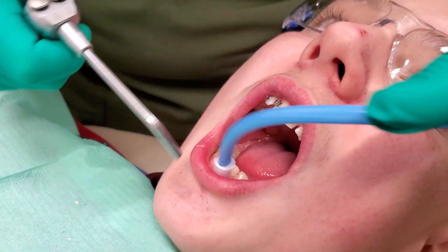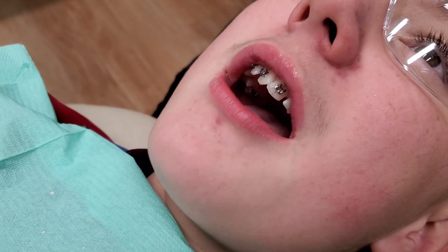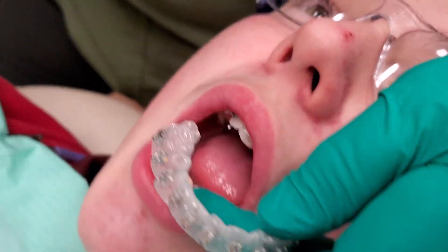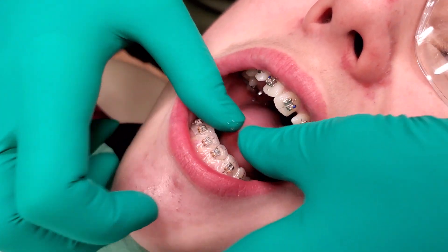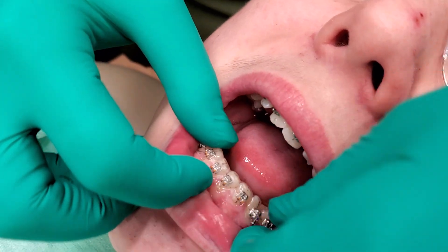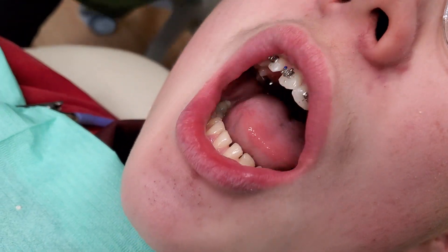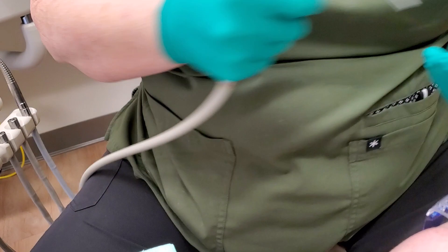It's an intense thing to do because you don't want to screw up — if the brackets don't go on right, it's like, oh no. So ideally before you do these, you really should make sure this fits. Every once in a while they've had some teeth that have come in a little bit more and it fits a little wonky. So just make sure everything fits fine. If it didn't — like sometimes their canine or premolars have come up a little and then it doesn't fit flush — then you would just cut it into sections, do maybe just two and two or three and three.